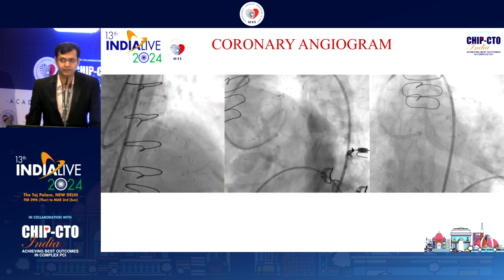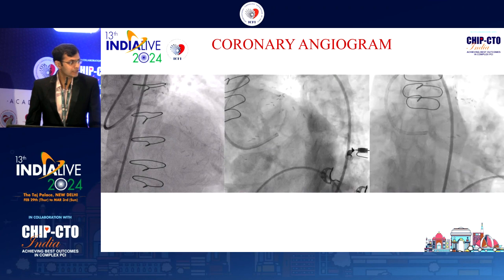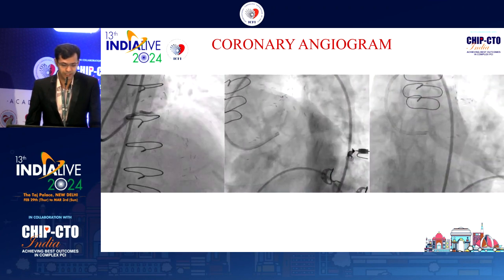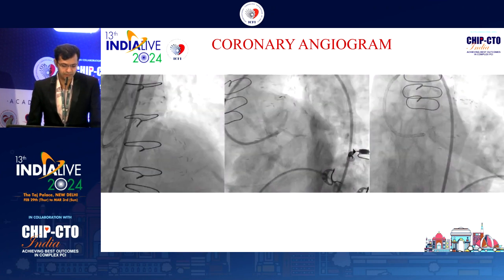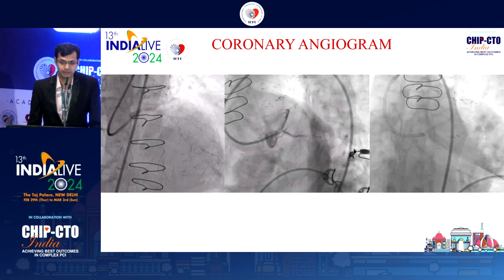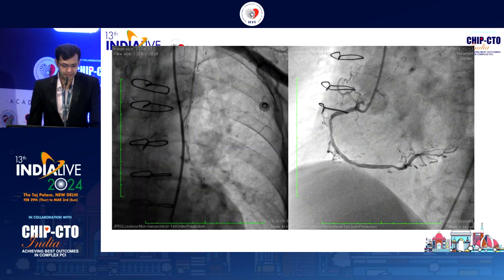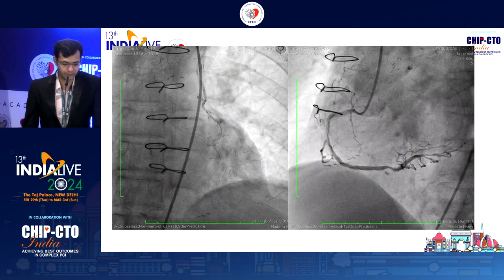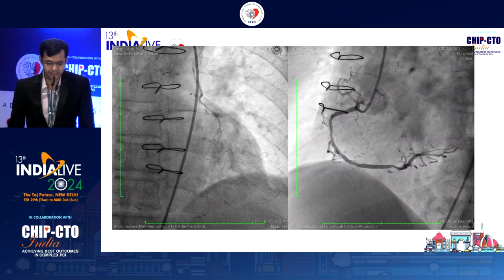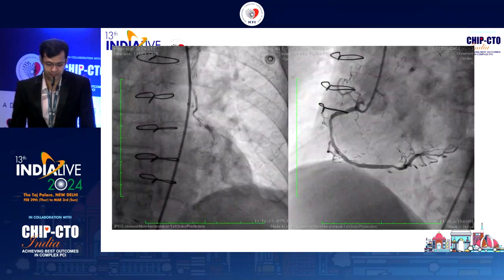We took the patient for a conventional coronary angio. The angio showed critical distal left main bifurcation disease with disease of the ostial circumflex as well as the ostial LAD. And we can see that the distal LAD is occluded beyond the site of the anastomosis of the LIMA to LAD. Again, we see that LIMA is occluded at the site of anastomosis with no filling of the distal LAD. And the RCA angiogram showed around 70% calcific disease of the proximal to mid RCA.